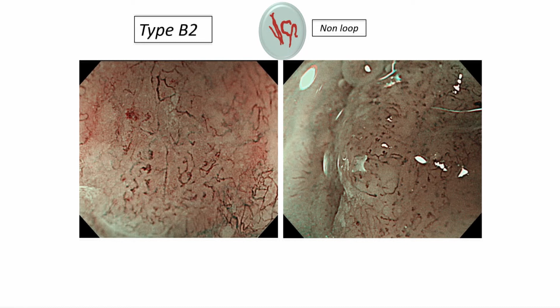Now you have B2, which is no longer looking like a hair clip. It is looking more like that other clip, what is the other clip that you call here? Shreya? The other one, the bigger one? Not the tight clip, the other one. Okay? It starts looking like that. Again you can see the area formation, yeah? And then you find this is opened up. That clip is opened up now. And this is B2. So it's no longer looking like a loop, it's non-loop or open.